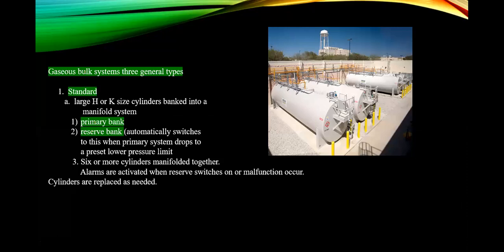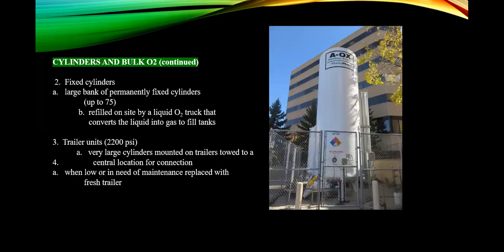All right. Gaseous bulk systems. Not a whole lot of questions on bulk, but you know, you can look at that. It's not going to ask a whole lot of questions about all the different types of bulk systems.